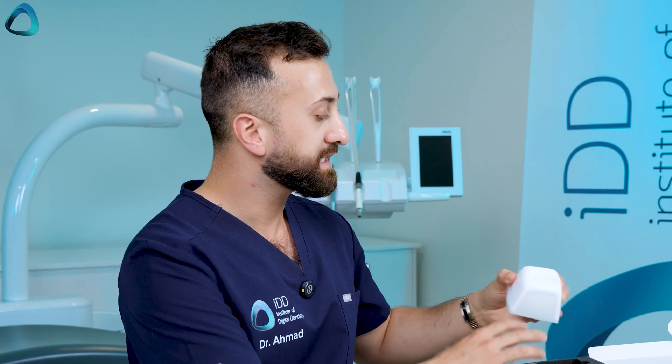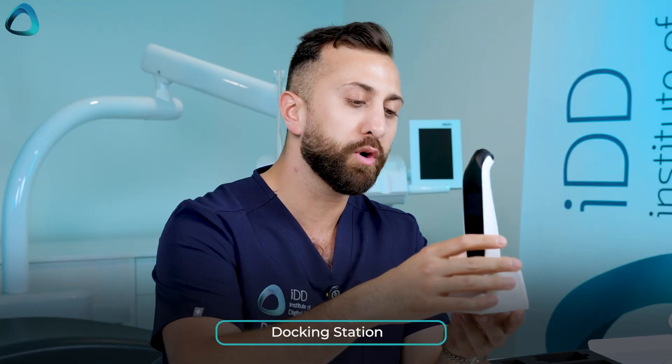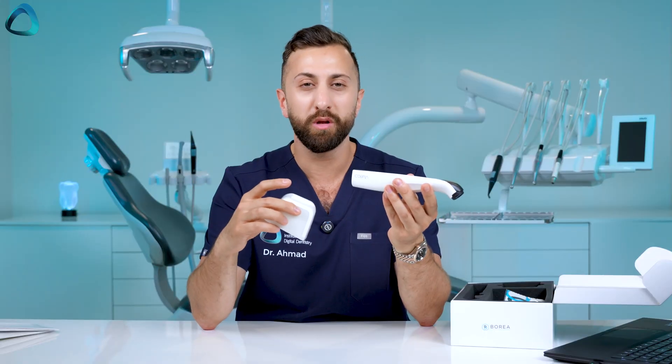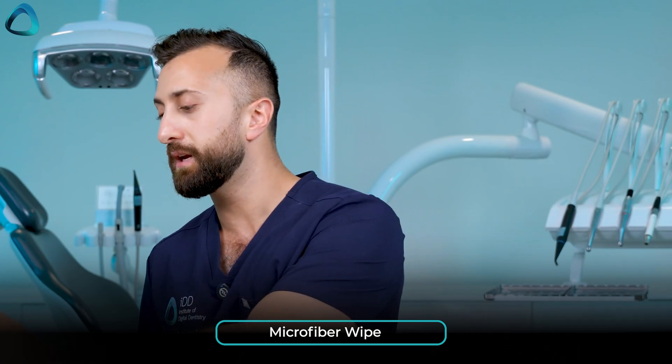We have a few other components and accessories. Here is the charging station for the Cobra — pretty straightforward, you place the device in like that and it starts charging. This is not a wired device; it has a battery, which makes it easy to use. We also have a microfiber cloth labeled with the Borea logo, used simply to clean the lens when needed.